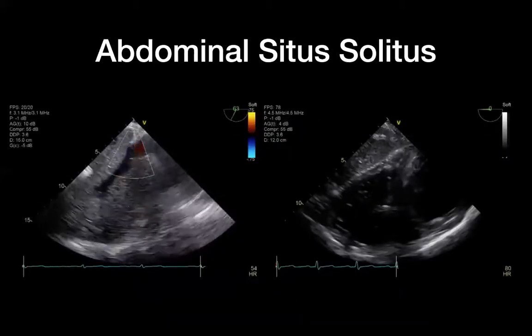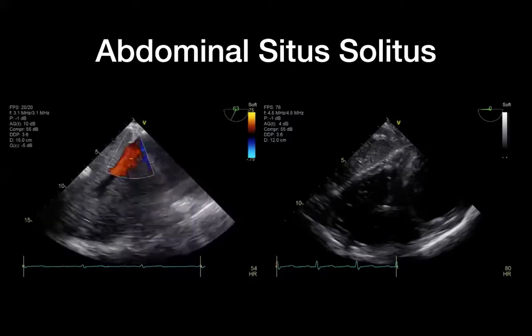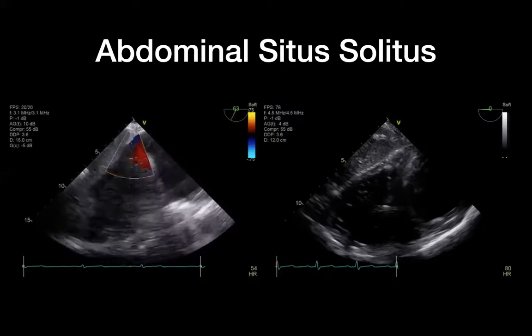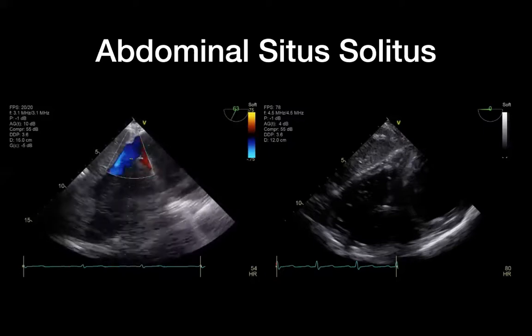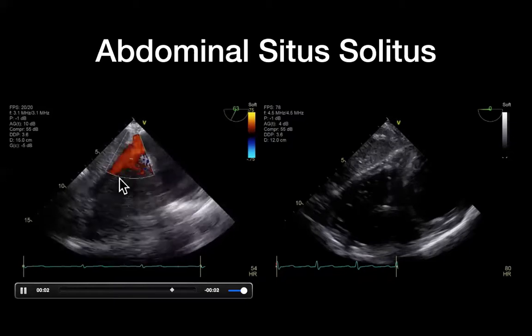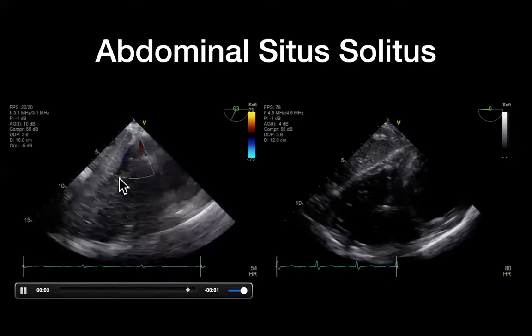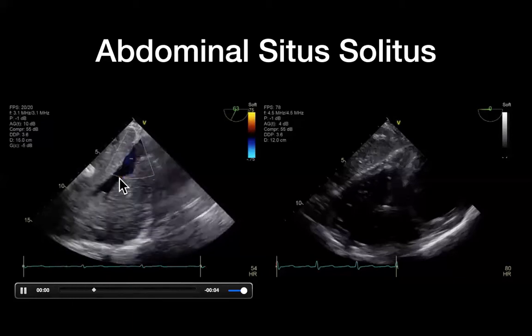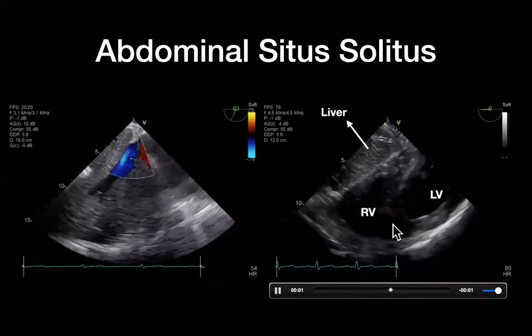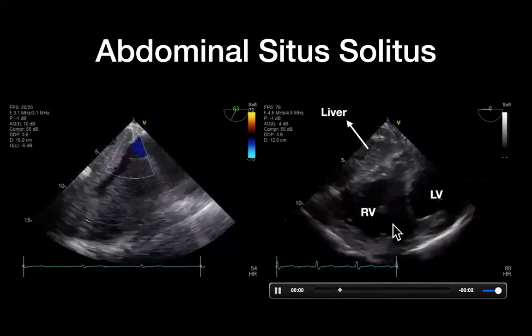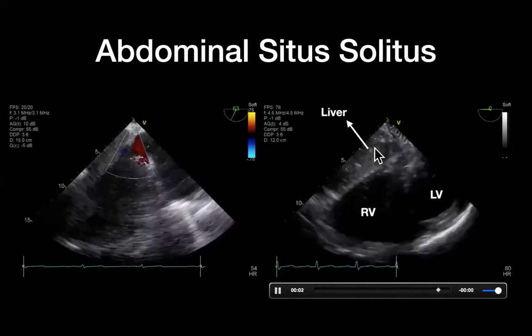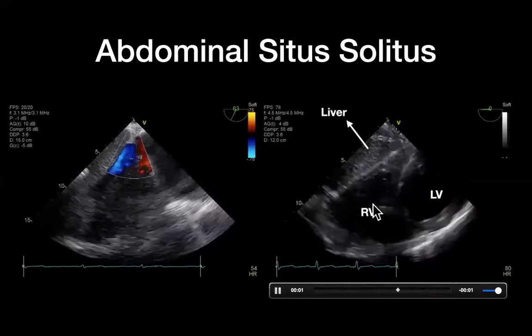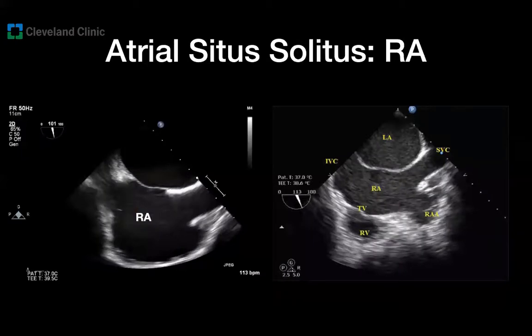Now let's go over how to use the TEE examination to figure out the visceral atrial situs. For the abdominal situs, we can use the liver. The video on the left shows the hepatic veins of a patient with a liver located on the right side of the patient — we can verify that very easily by turning the probe to the right from one of the transgastric views. The video on the right from a transgastric view at the base of the RV shows that the liver is located on the right side and is very closely related to the anatomically right ventricle. To determine the atrial situs, I rely heavily on two things: the atrial septum and the morphology of the atrial appendages.